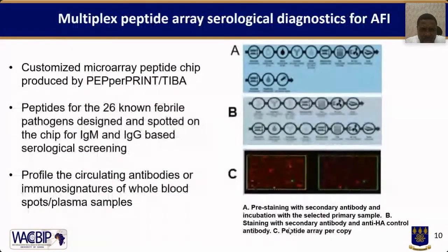Next slide, please. So we see the potential for the TaqMan Array, that it is doing something good. But one thing about the TaqMan Array is that it's a bit expensive, and you need well-trained personnel to handle it. And the PCR machine is not something that we find in every diagnostic lab in our hospitals. So we're thinking of something very feasible, something that we can actually use without much problem.